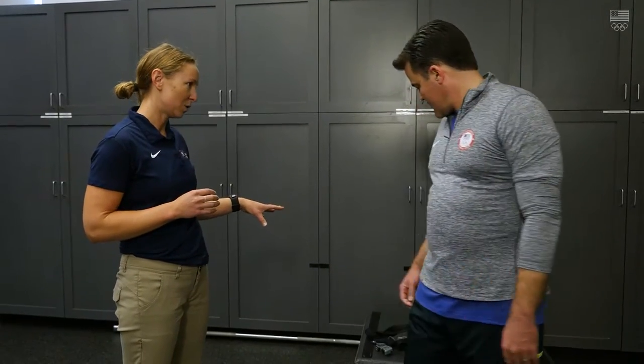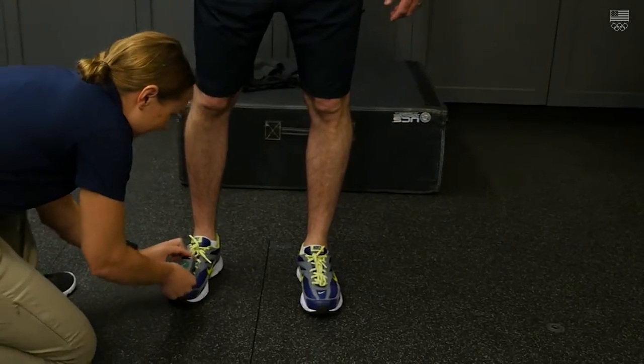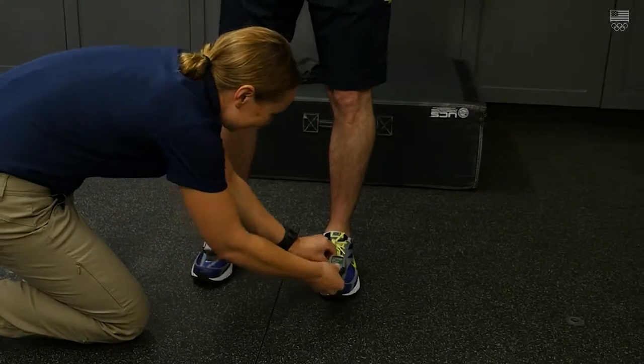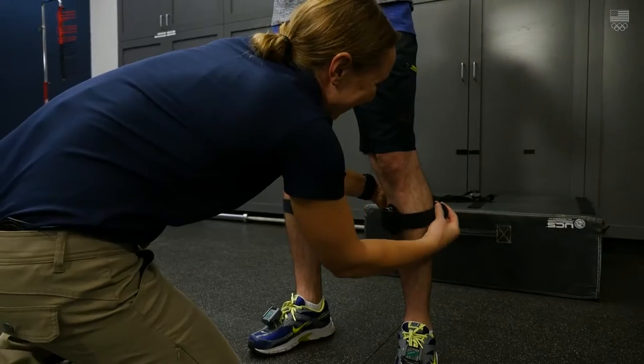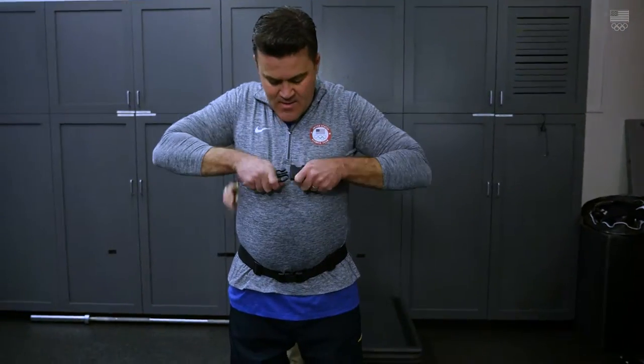First thing we're going to hook you up with some motion sensors. These motion sensors will look at 3D motion analysis. We're going to start with these and hook you up basically from the bottom up, and then we'll get you jumping on the force plates too.